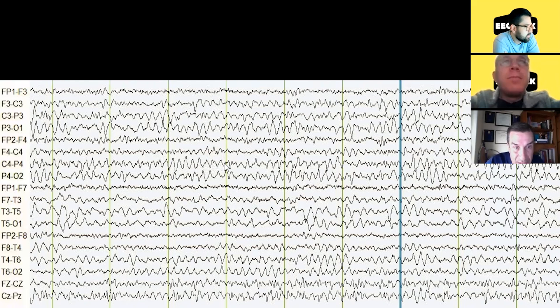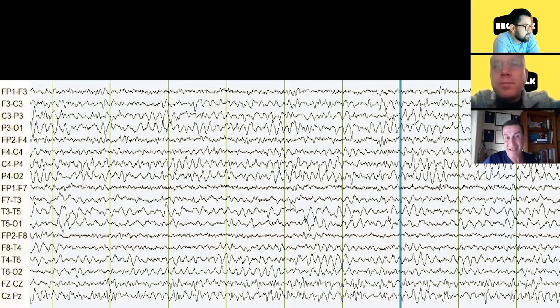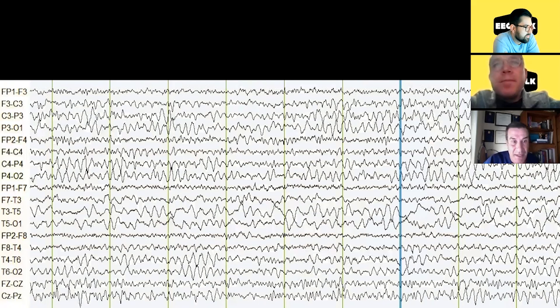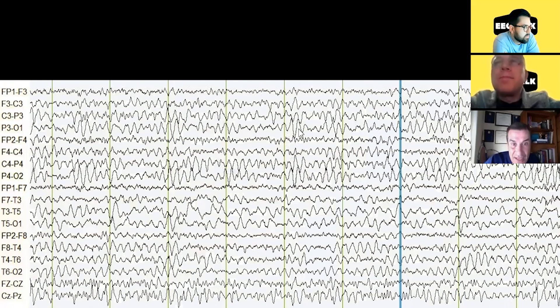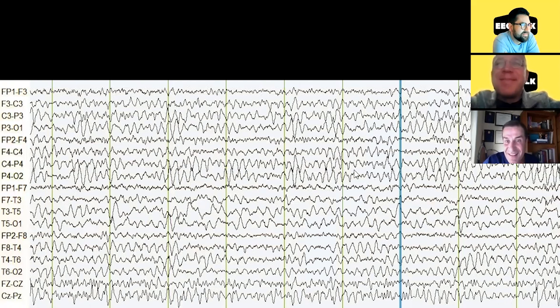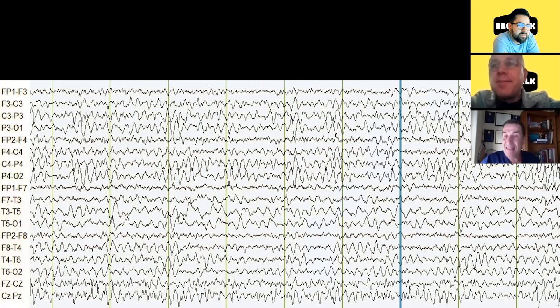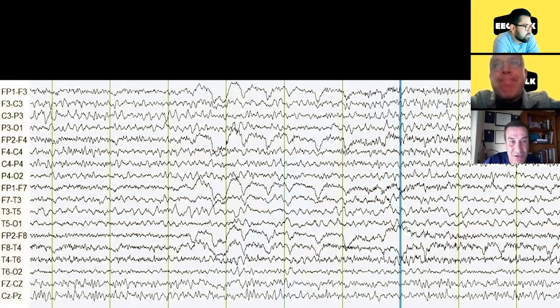This patient has a nice-looking alpha rhythm — one, two, three, four, five, six, seven, eight — well formed and fairly symmetric. As mentioned earlier, the left temporal area looks like it has abnormal slowing, mild but it's there. Here you can see really dramatic slowing — almost continuous slowing in that area. But these waves are getting higher in amplitude; it's really an ongoing rhythm. When this patient gets drowsy and the alpha rhythm starts breaking up, these will give the illusion that they stand out. Let's see when the patient gets drowsy.